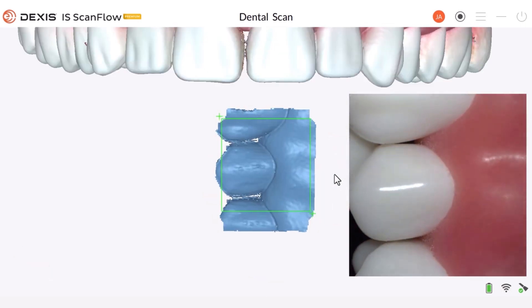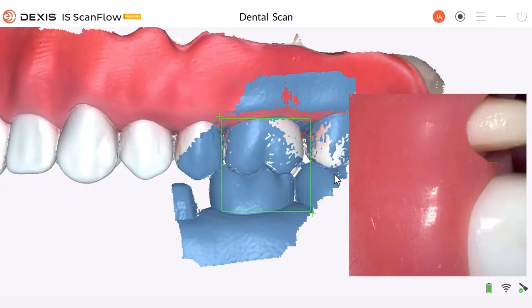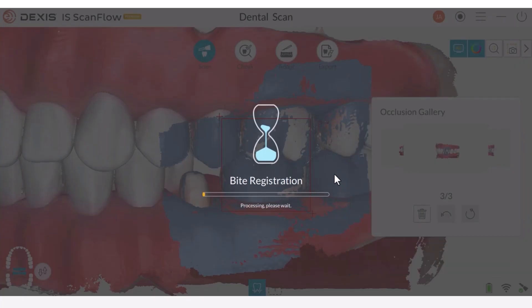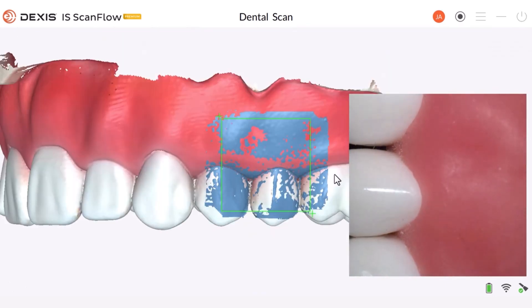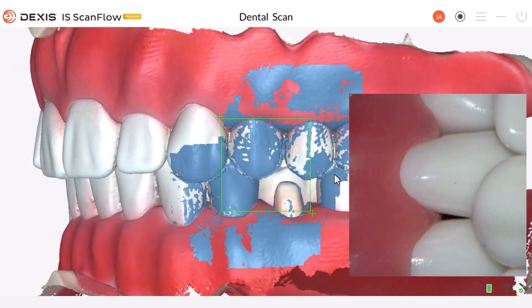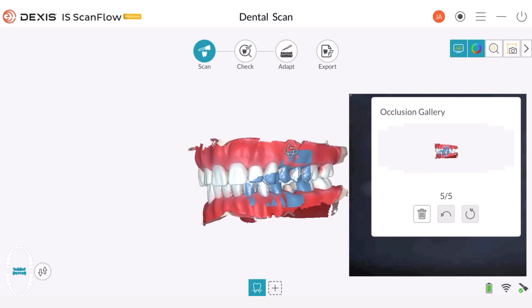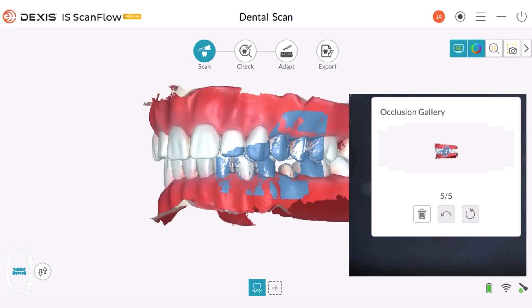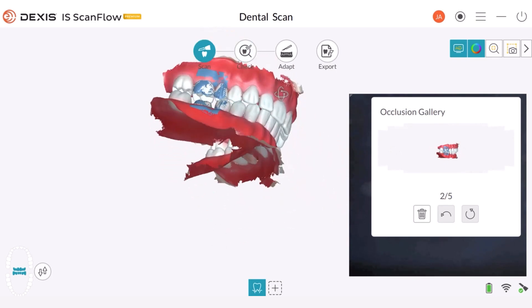Repeat the process on the other side. If you encounter issues with capturing the bite immediately when moving toward the opposing arch, adjust your position slightly mesially or distally. For an anterior scan, it is recommended to scan from first premolar to first premolar. The buccal bite registration can be acquired in the premolar region of each side as well as in the anterior region. Please note, it is not recommended to include the anterior teeth in a buccal bite registration if the teeth are edge to edge. Once again, assess each of the bites from above and below to ensure accuracy before proceeding.